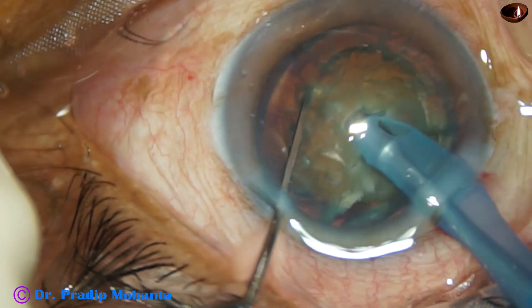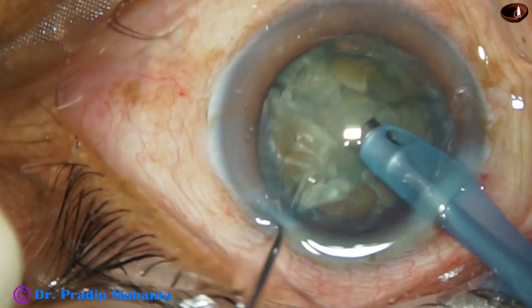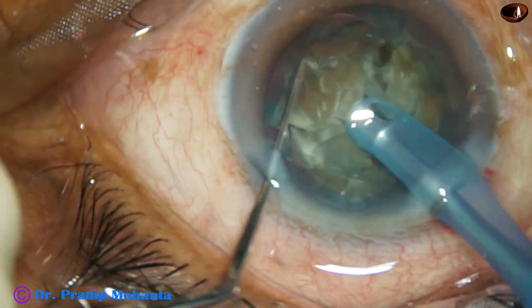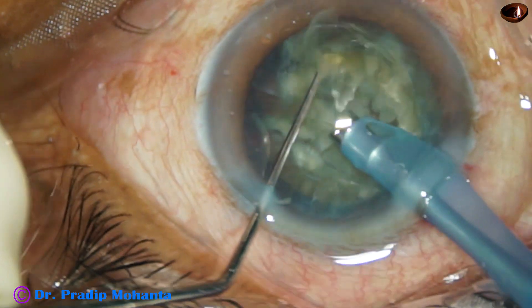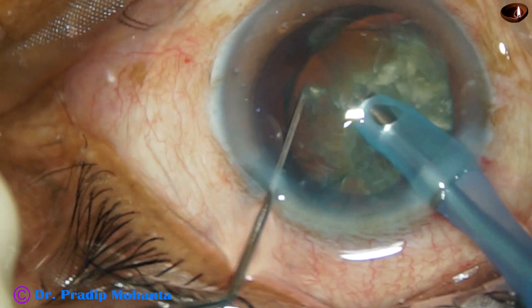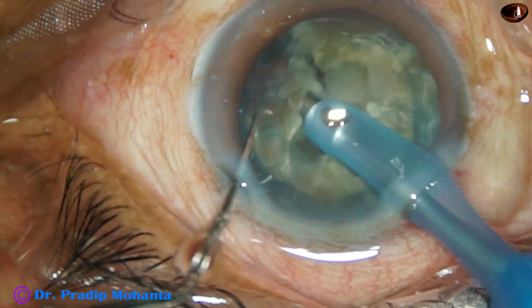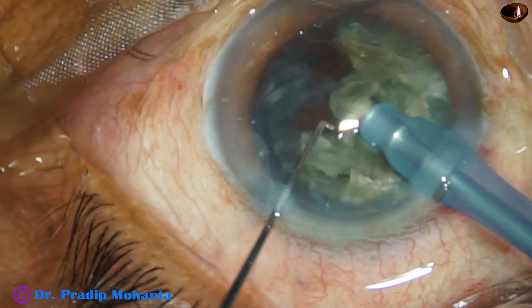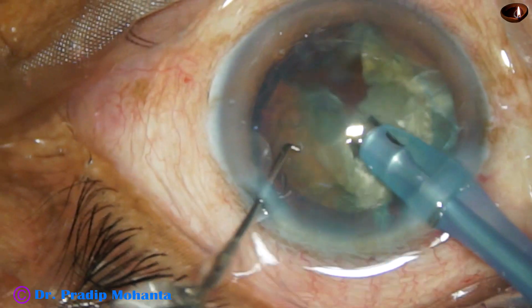The nucleus is chopped at another place, 90 degrees apart. And now another chop. This is the other hemi-nucleus. So by several chops, multiple fragments have been made.